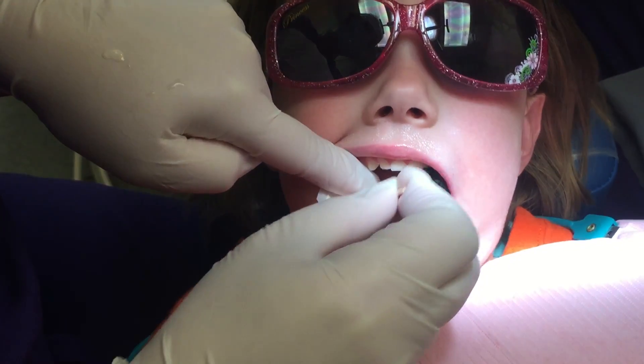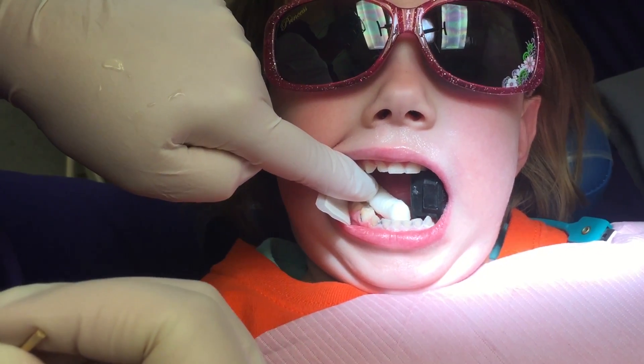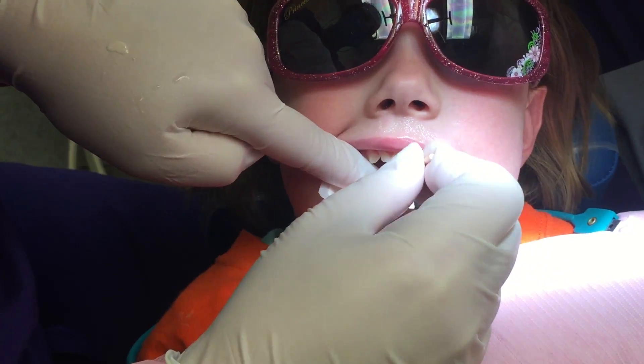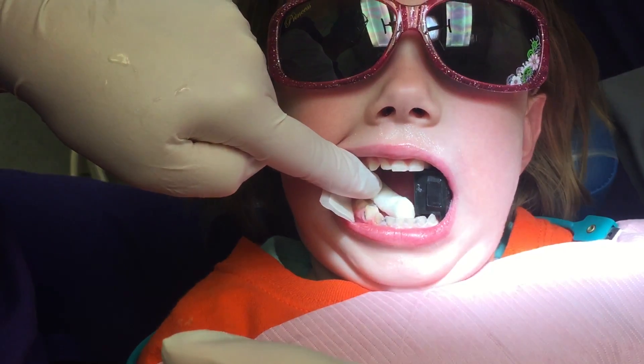So you're not putting any SDF on that? It already has it — yeah, it already has it. I'm taking the SDF off the tooth now and we're just charging out for the glass ionomer on it. Is that what we're doing?